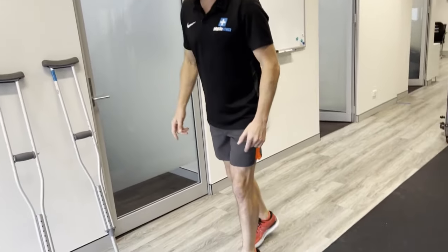When going upstairs, good leg goes first. If you try to put the injured leg up first it's too hard — you can't properly load through it. There's no point doing that until you've got the range and strength. Go good leg first. Once you've built enough strength and range, then you can do injured leg first: commit over that leg, push up, then step the good leg up.